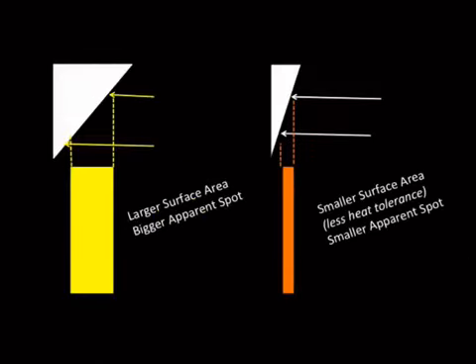Okay. So I mentioned this before, that mammography requires a really, really good spatial resolution, more so than you get with normal imaging. So to achieve that, you have to use a smaller focal spot. To put things in perspective, mammography typically uses a focal spot that's around 0.3 to 0.1 millimeters, relative to general X-ray, which uses a focal spot that's 0.6 to 1.2 millimeters. So we're talking about half the size or a tenth of the size, so it's a lot smaller.